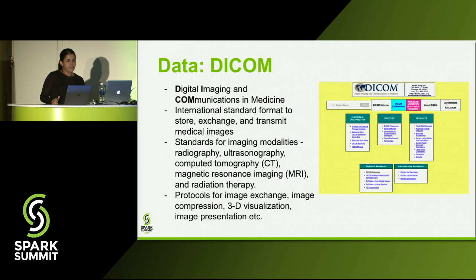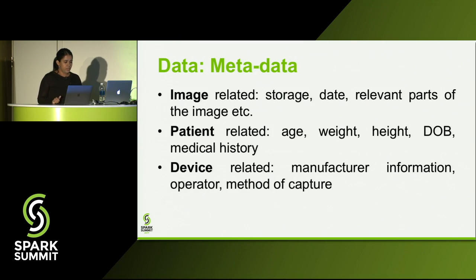So I'll just introduce our data first. Like the talk suggested, this is DICOM. DICOM stands for Digital Imaging and Communications in Medicine. It's a standard format that is used to store, exchange, and transmit data, medical data specifically. It has its standards for quite a few imaging modalities like radiography, ultrasonography, CT scans, MRIs, radiation therapy. It's not just an image storage format, but it also has protocols for visualization, compression, and image presentation. So that was the image data that we had.